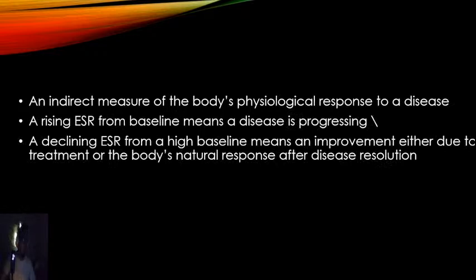First off, it's an indirect measure of the body's physiological response to a disease. Rising ESR from baseline means a disease is progressing, and a declining ESR from a baseline means an improvement, either due to treatment or the body's natural response after disease resolution is observed.